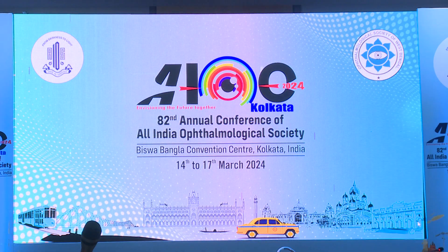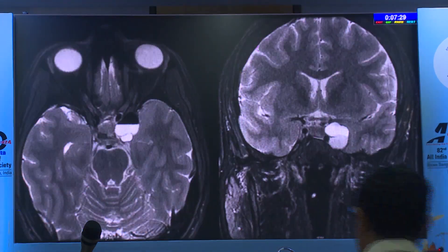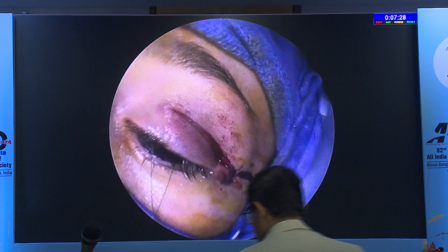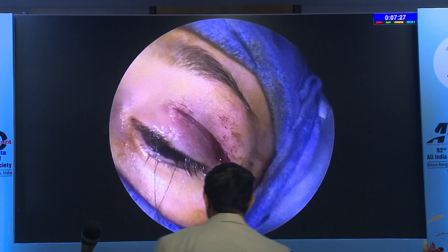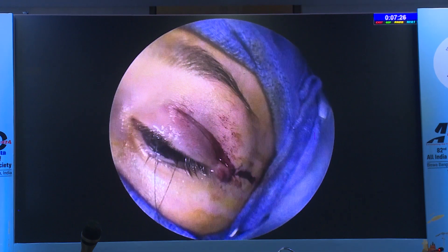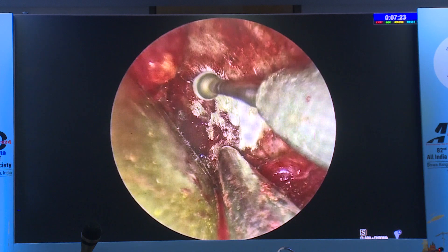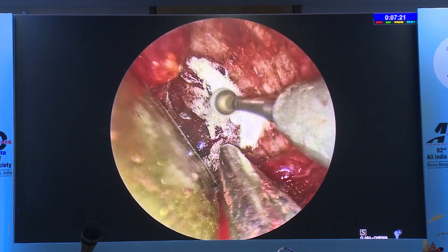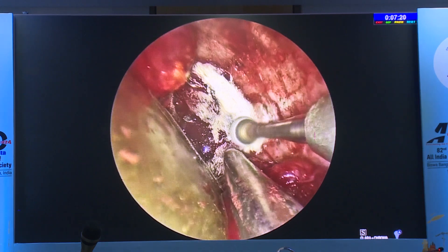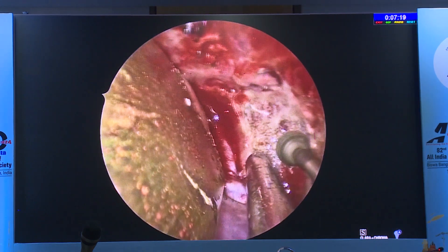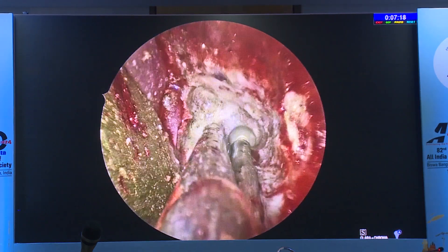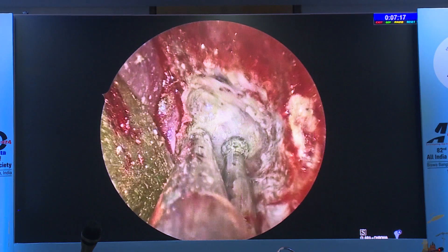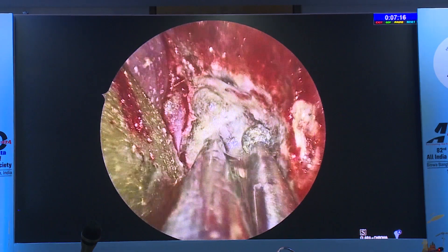Dividing the meningoorbital band is the key initial challenge when learning this approach. The approach involves just an eyelid crease incision, dividing the orbicularis, subperiosteal dissection, and then drilling the bone between the greater wing of the sphenoid—basically between the superior and inferior orbital fissure.